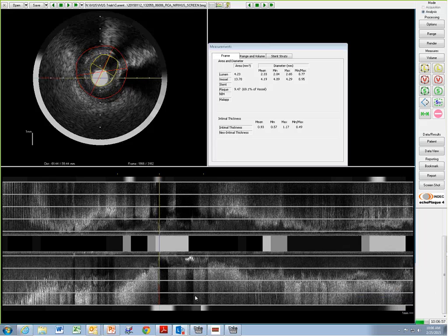But I can see many series of cases like this, with that non-corrupted region there. Somebody feels this is suitable, and somebody doesn't, so we have to make a clearer consensus for everybody.